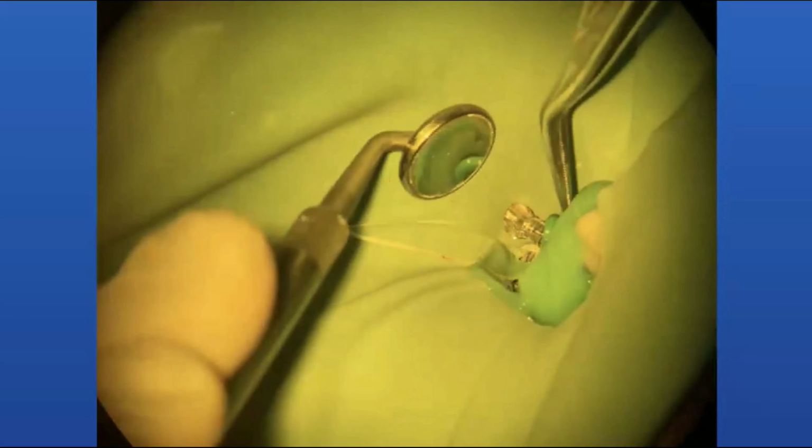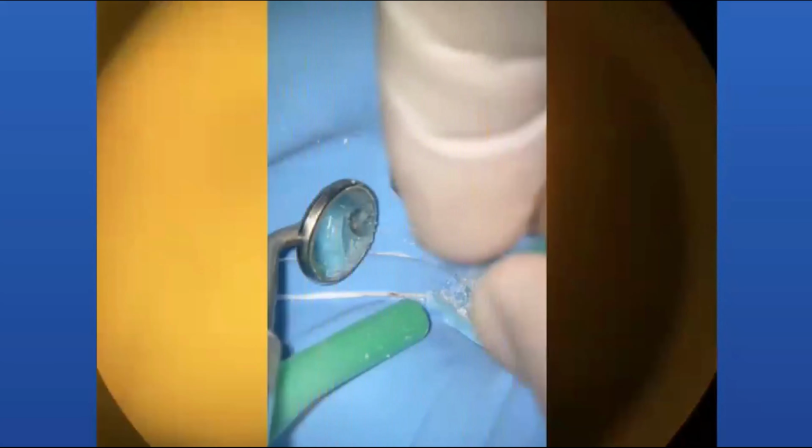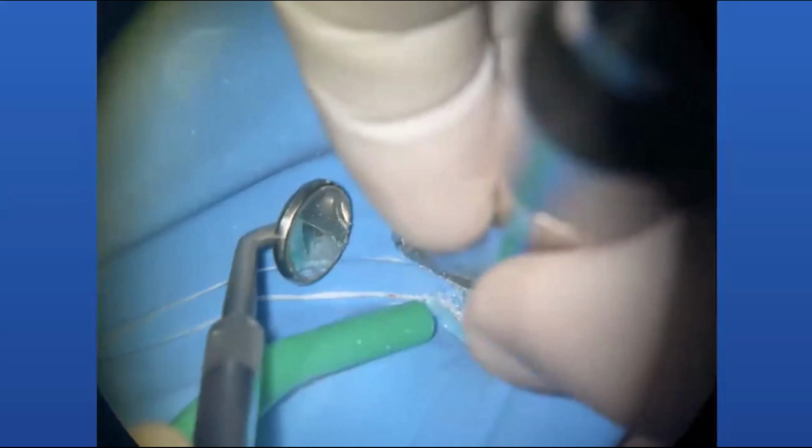And exactly as Matt had shown, this is one of these circumstances where I get to place the sound seal. What I do differently than Matt is I like to create a union between the sound seal that was placed from the platform and the sound seal that I had placed before. That just gives me more stability. But again, to each their own. And in this case, we cure again, we reassess, and we're good to go.